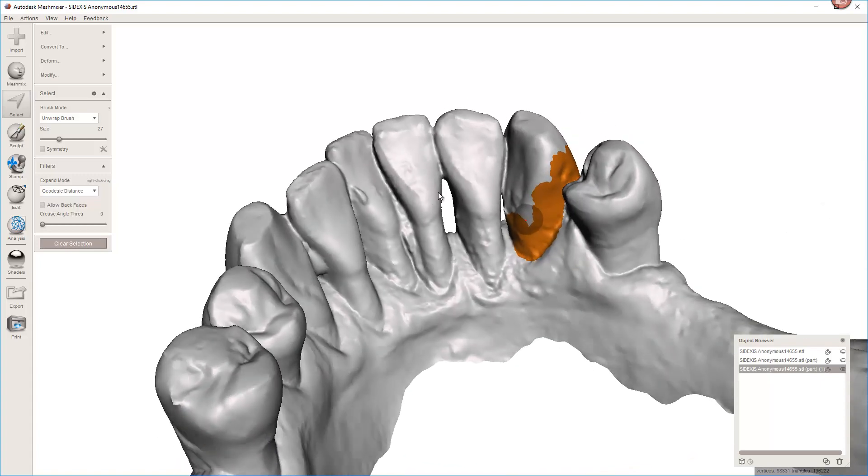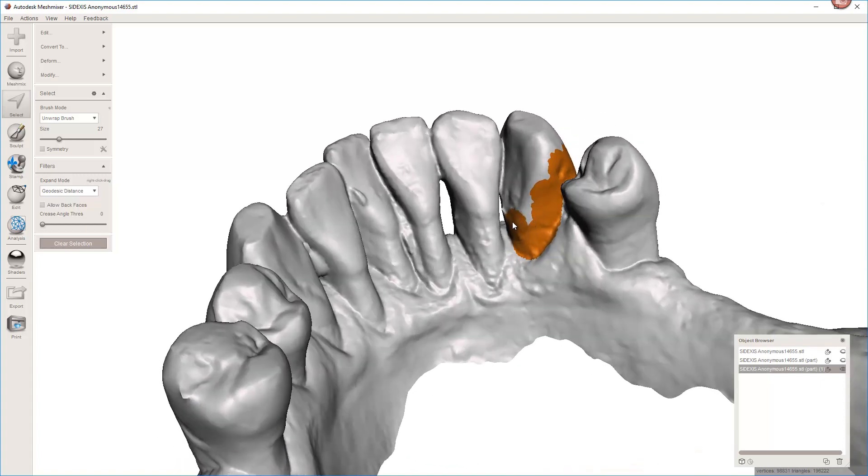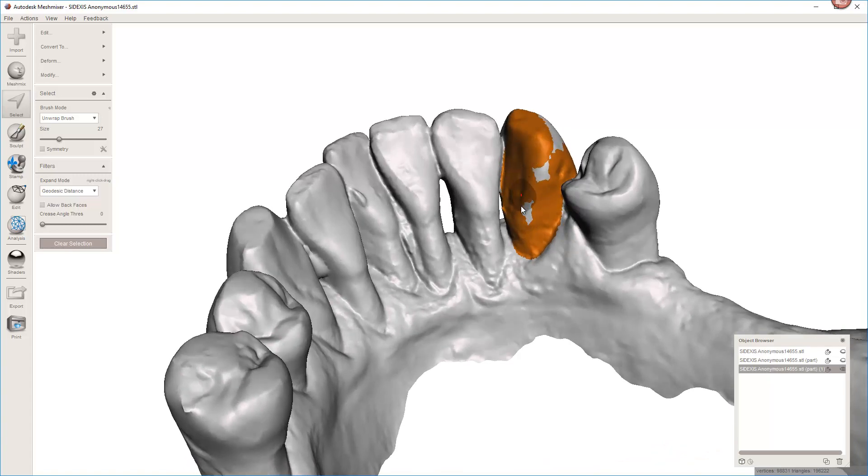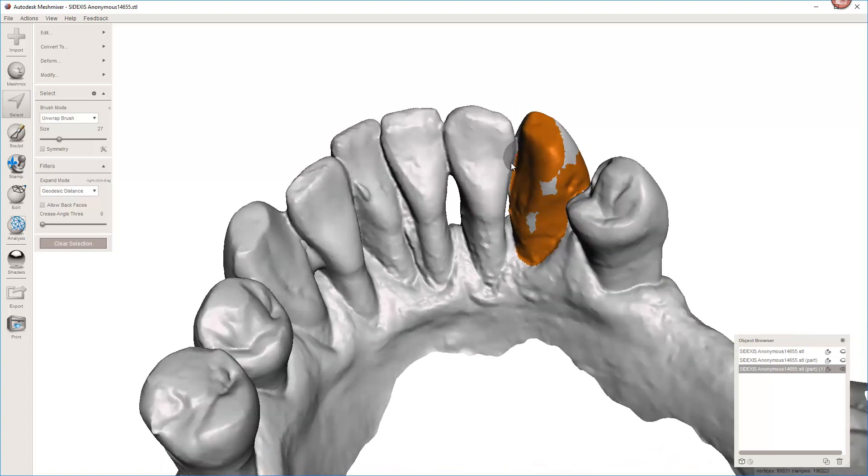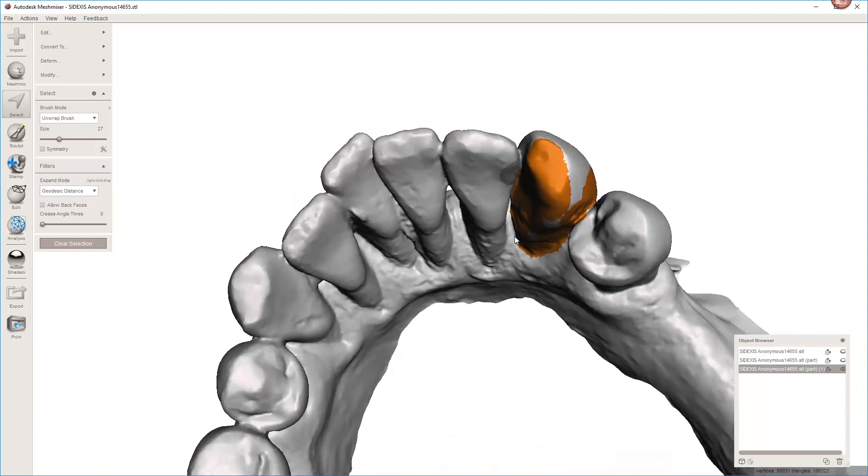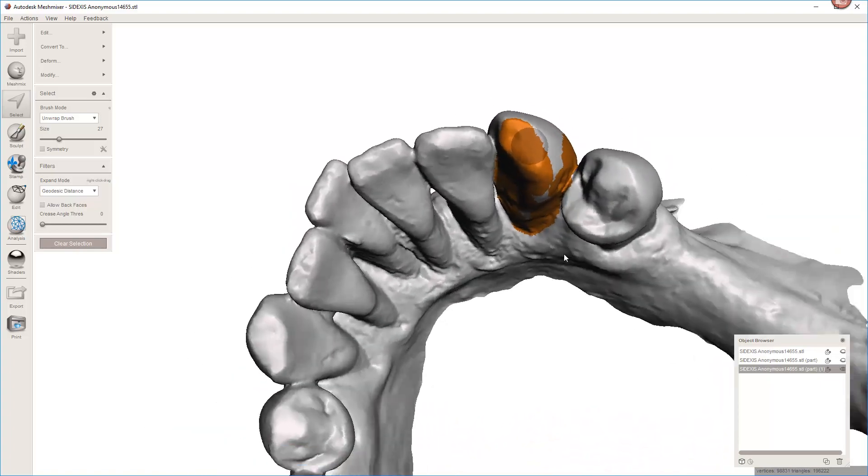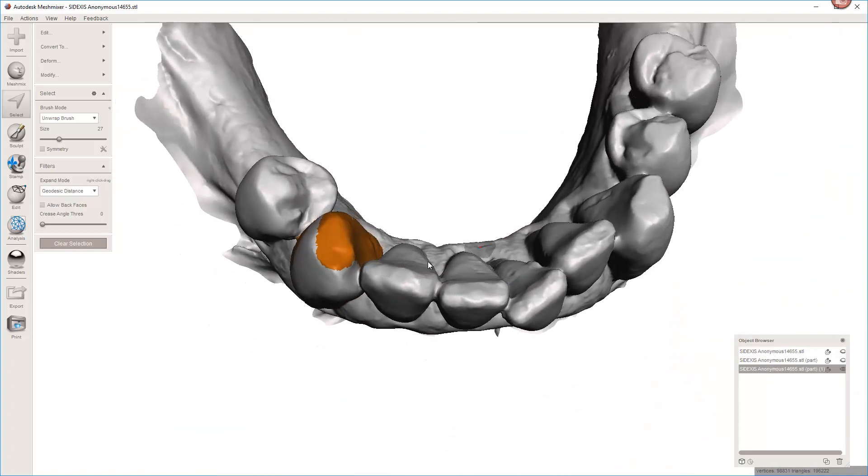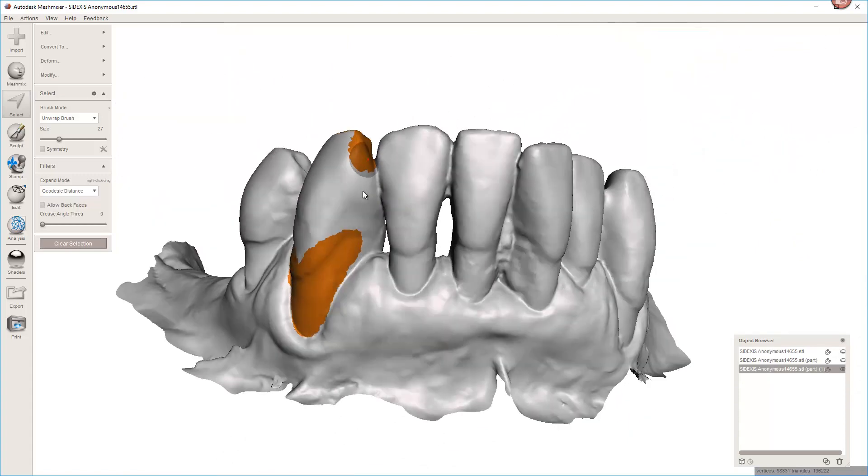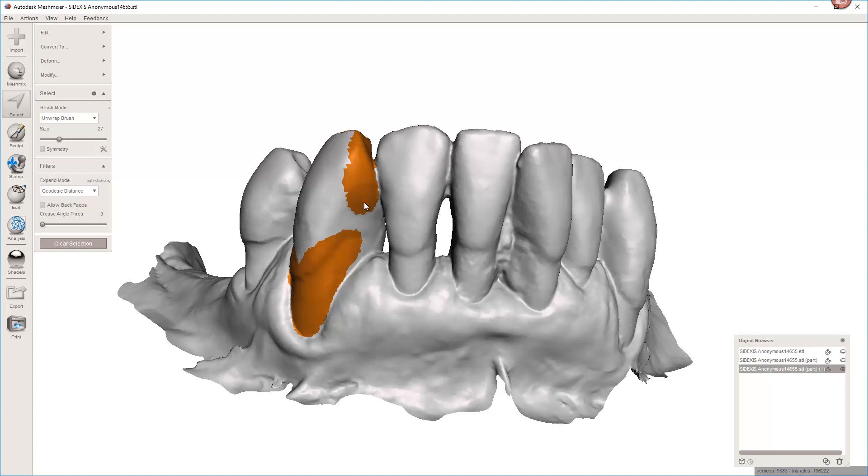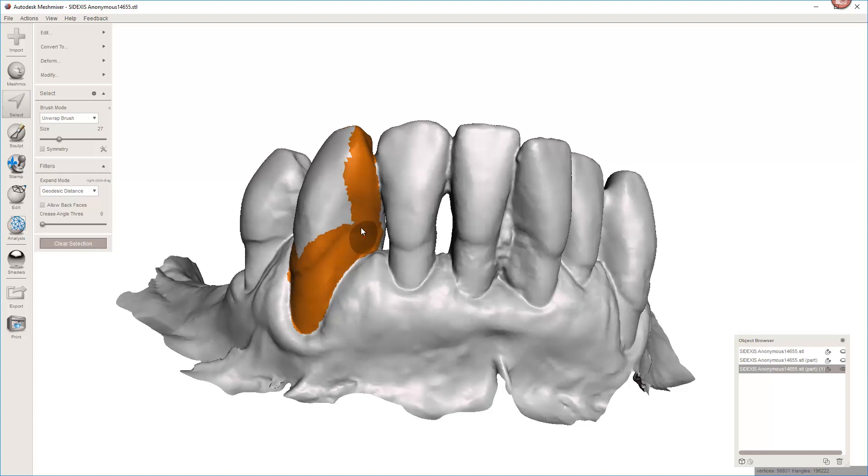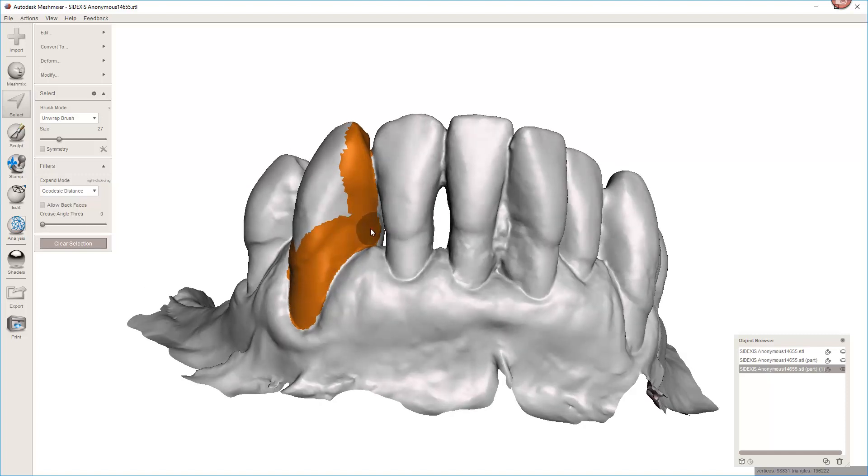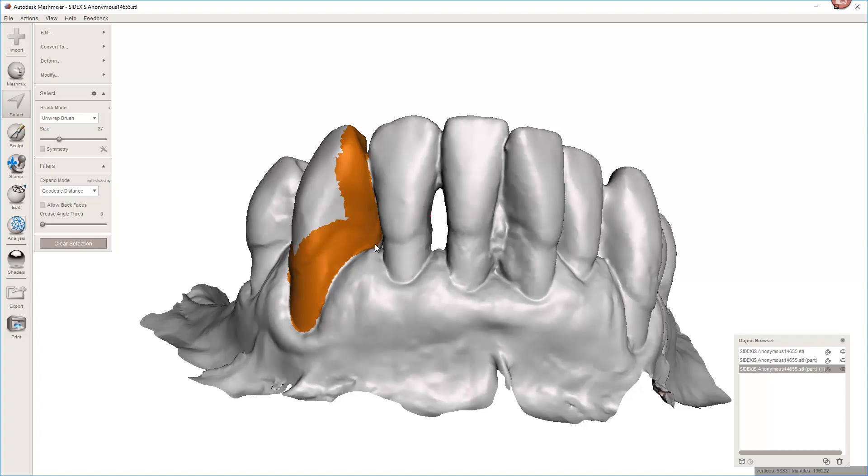If I get a little bit of bleed over past the margin, it's not a big deal. I do want to have positive error. I want to leave extra tooth surface on the adjacent tooth if possible. I don't want to accidentally remove tooth surface. On a case like this, it's not a big deal because I'm taking the tooth out anyways, but I don't want to have to think about that during surgery.